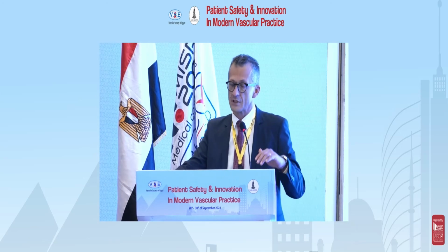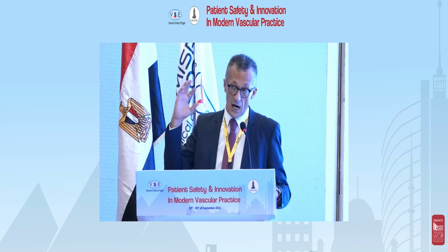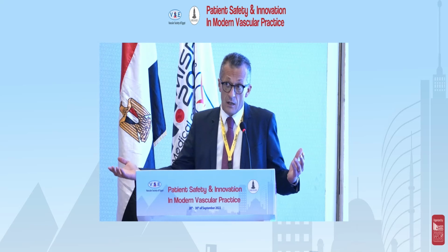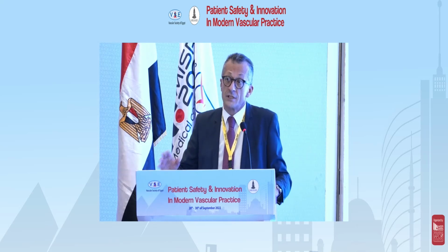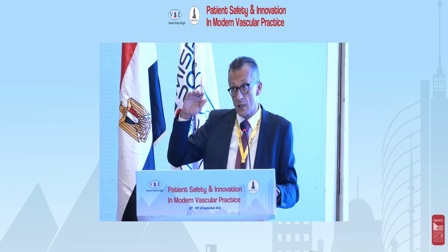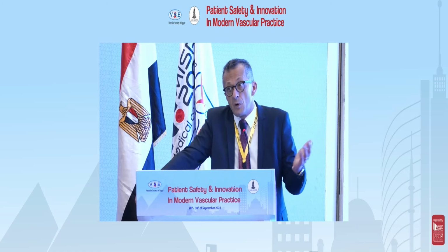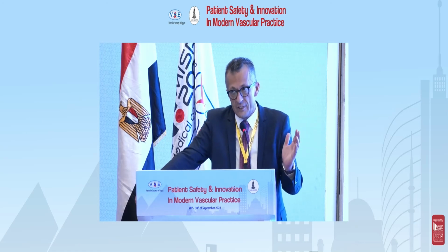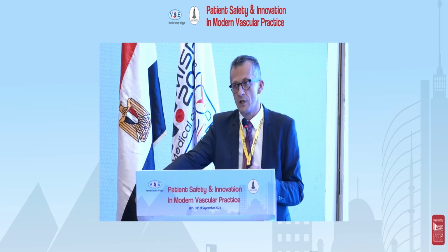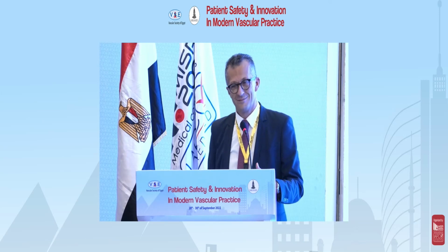In 60% of cases, due to a residual thrombotic material, chronic thrombotic material around the limb, we perform a relining. Of course, it's material in material, but the reason is to avoid thrombotic material and then the risk of an acute thrombosis. We didn't have problems with this. Of course, material in material is not a good idea, like when we perform a relining of SFA or POP stent. Yes, thank you. Thank you, Dr.